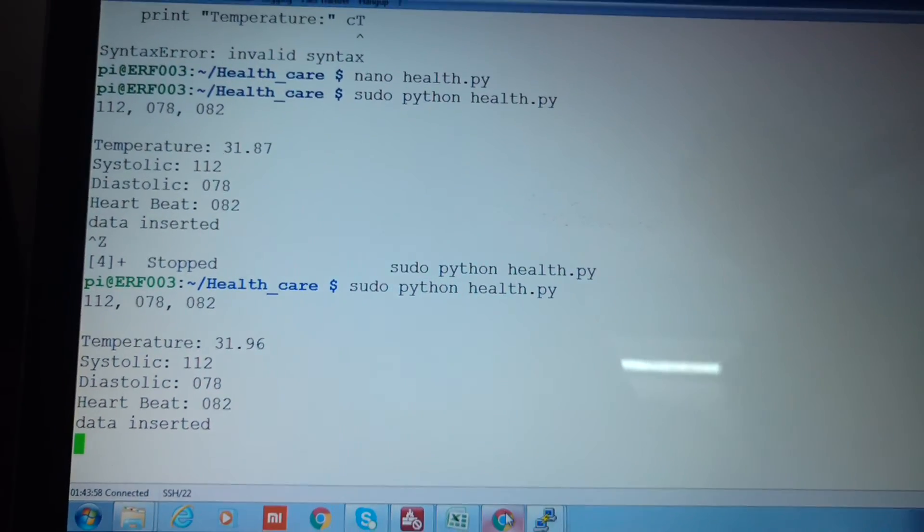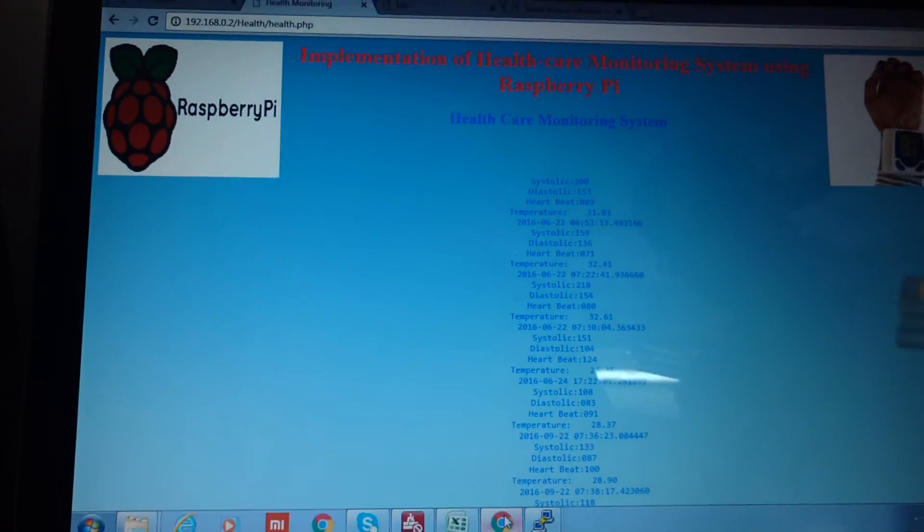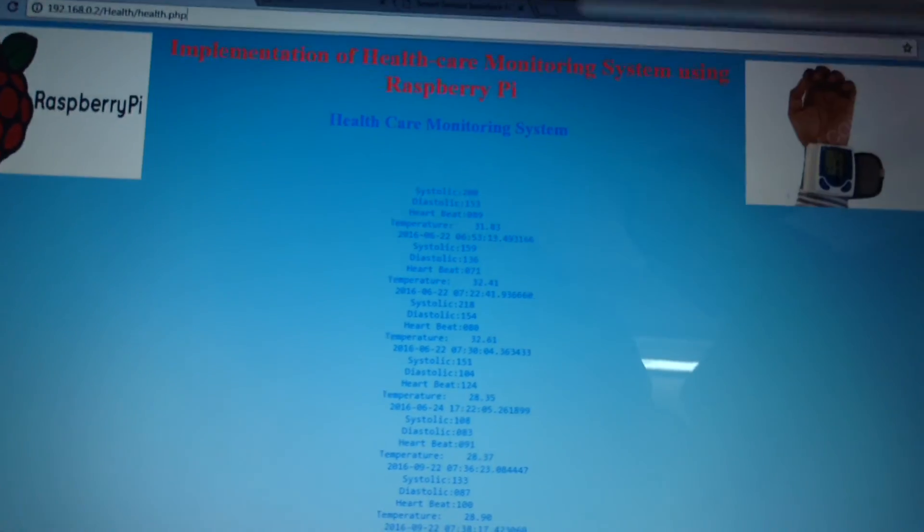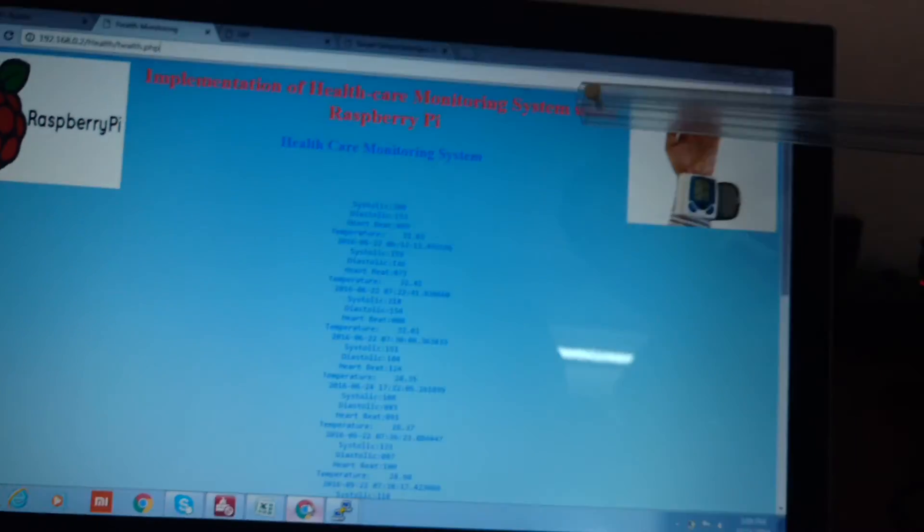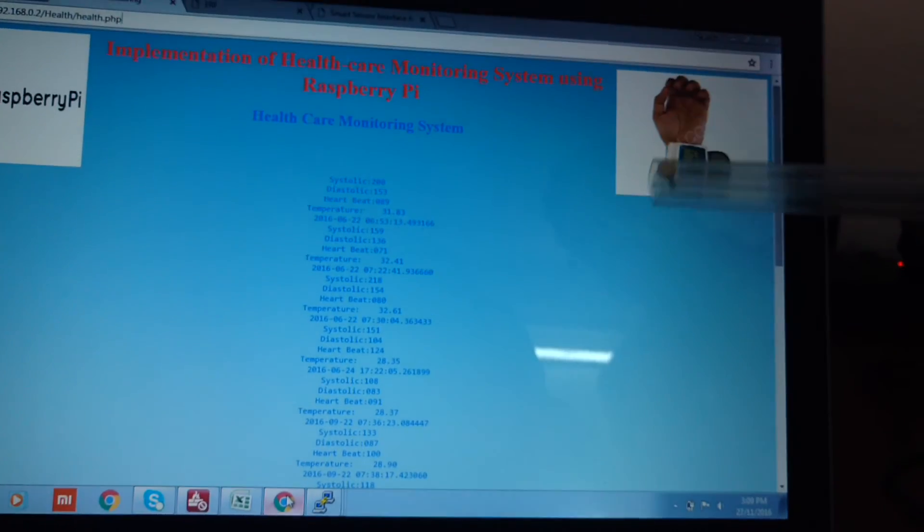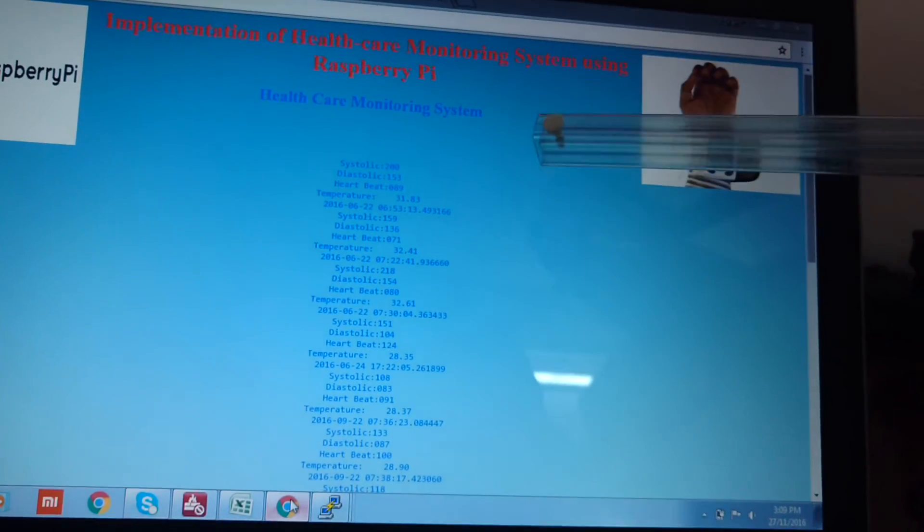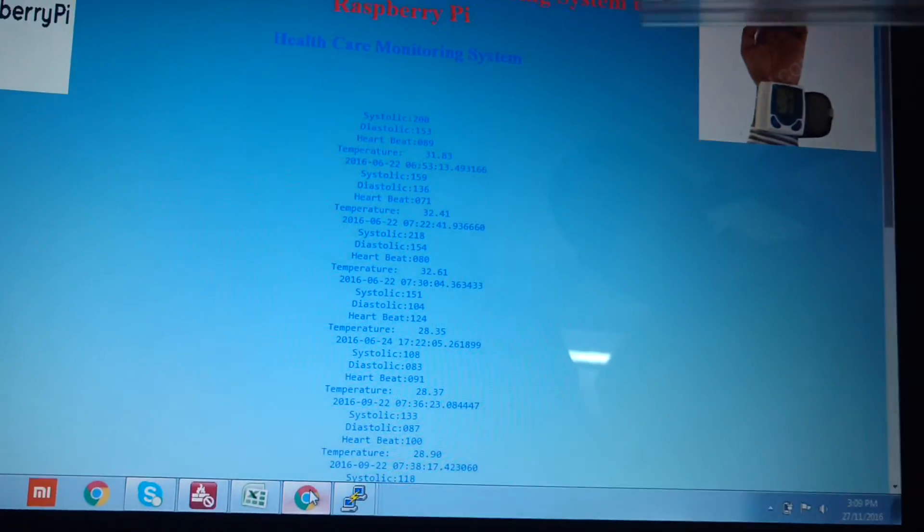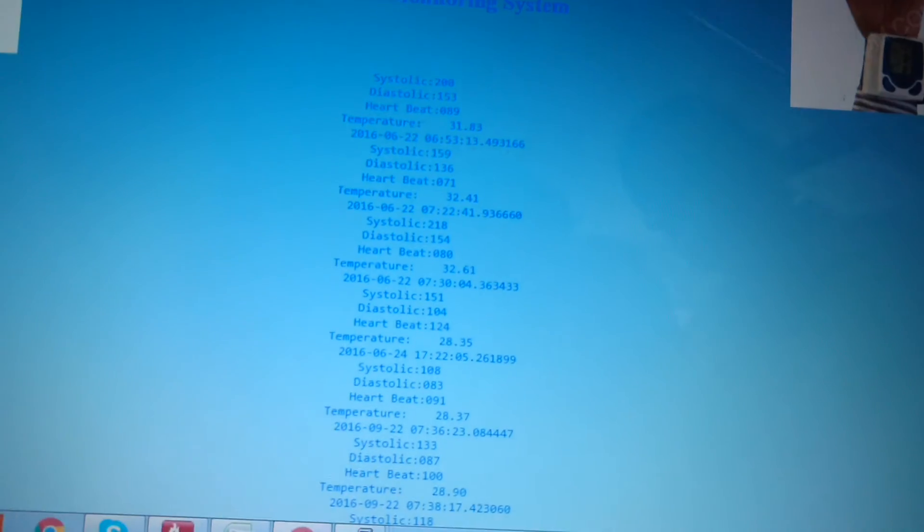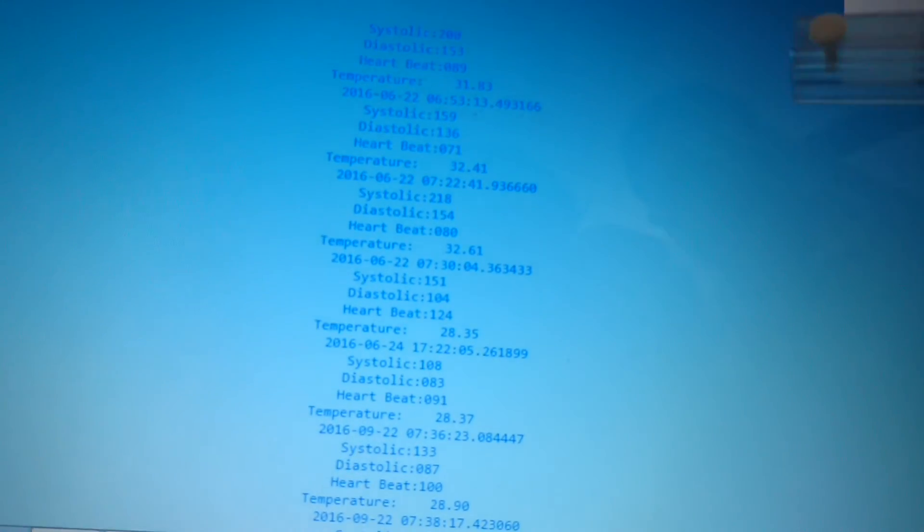We have also designed that web page which says implementation of healthcare monitoring system using Raspberry Pi and you can see that all the values that have been logged in the text file are being displayed here.